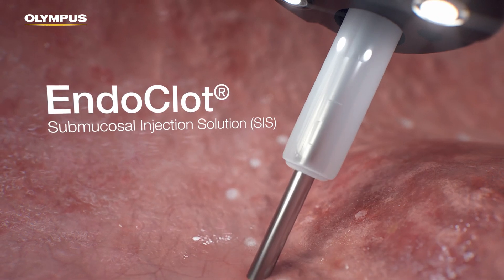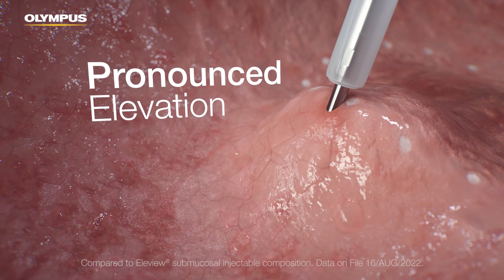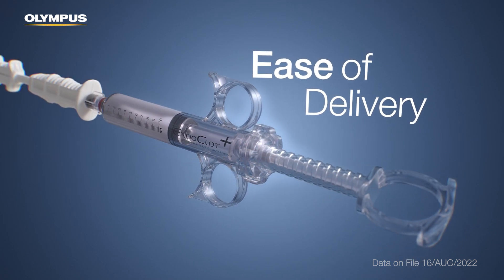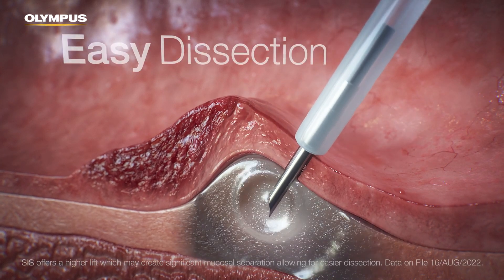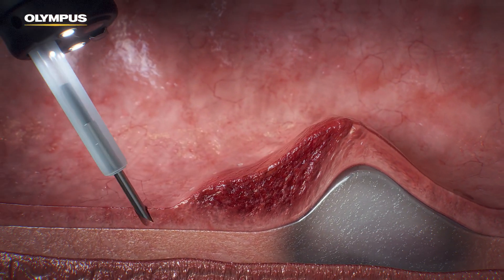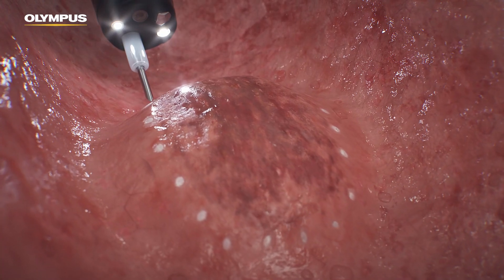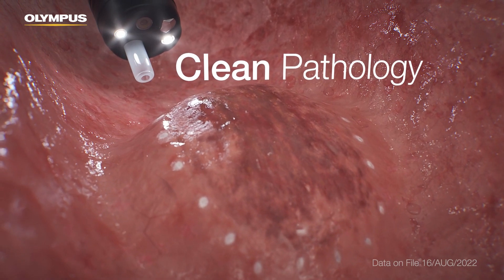Endoclot SIS offers longer and higher lift compared to Elevue Submucosal Injectable Composition. With a specifically designed spiral syringe, Endoclot SIS is intended to be delivered to the targeted area accurately. It is designed to offer a high lift, which may create mucosal separation, and uses the same proprietary absorbable modified polymer particles as the Endoclot PHS. Endoclot SIS does not leave artifacts that may cause abnormalities during pathological investigations.